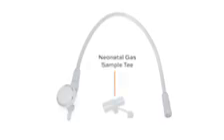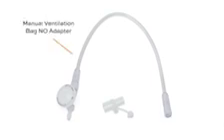The neonatal gas sample tee is used to connect the sample line to the inspiratory limb of the ventilator circuit. The manual ventilation bag NO adapter is used to connect the oxygen tubing to deliver the Genasil nitric oxide gas during manual ventilation. It includes an NO injection port to connect to the manual ventilation line.